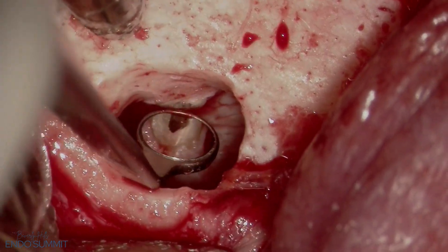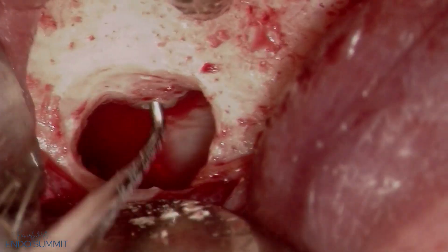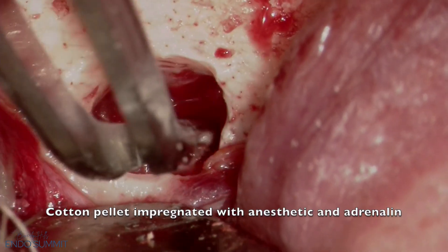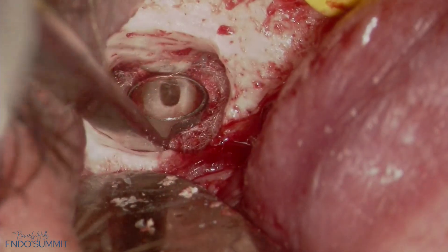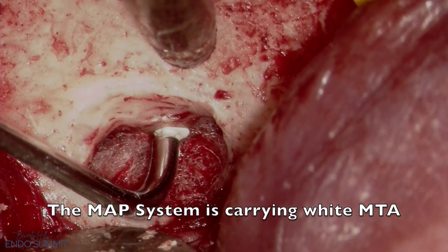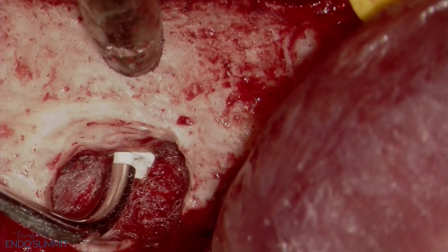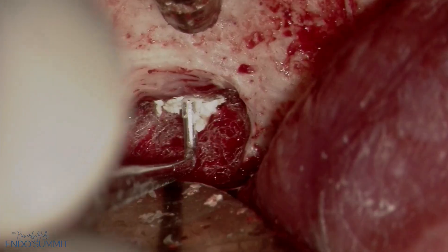A micro mirror is used to check the retro cavity. The plugger is fitted to the retro cavity, and the same plugger will later be used for the retrofill. Next, a cotton pellet with local anesthetic and epinephrine is used for hemostasis — for this surgery, a 1:50,000 epinephrine is used. The pellet is left there during the retrofill for hemostasis, and it's very effective. He's then using the MAP system — the micro apical placement system — to carry the MTA into the retrofill. It's applied to the retro cavity, and a microsurgical plugger is used to condense the MTA. Additional MTA is delivered and further plugging is applied, with the process repeated a few times as needed.